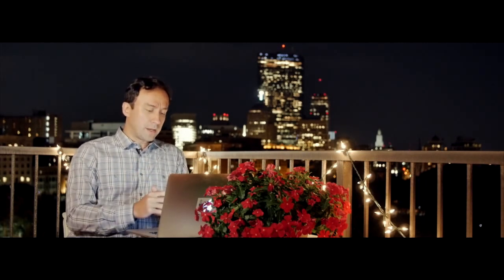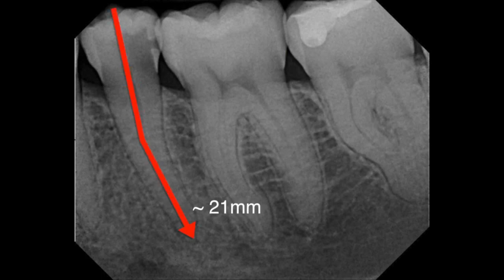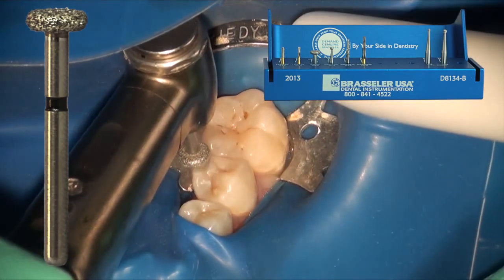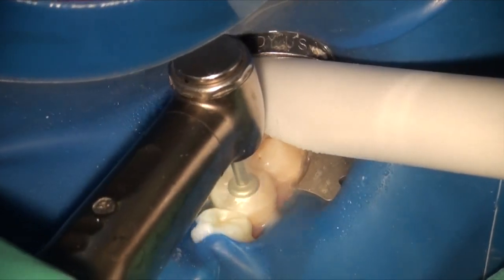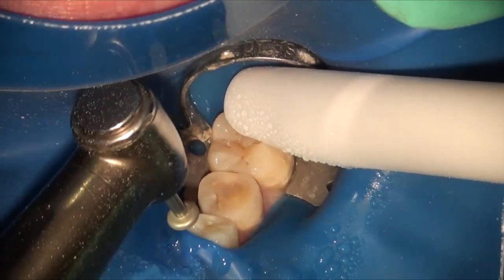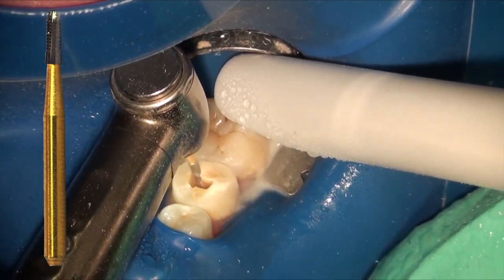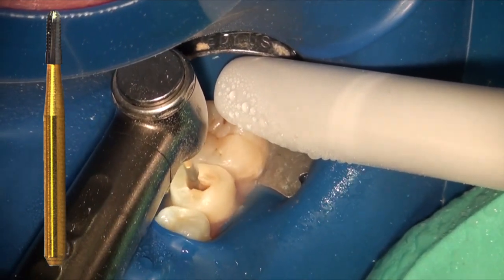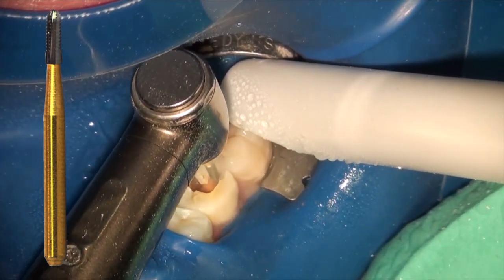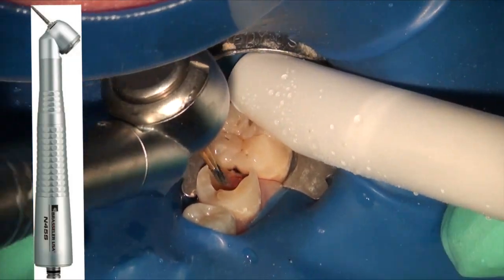Before we do anything else, we use our digital radiographs to get an estimated length. Here we have about a 21-millimeter estimated length. Then, from the Real World Endo Access Kit, the first bur we use is the flat diamond to flatten the cusps — getting stable reference points and reducing the occlusion. Then I use the 1558 saber cut bur, which is a fairly aggressive bur great for outlining the preparation quickly. I quickly create a distal box and remove the gross decay.